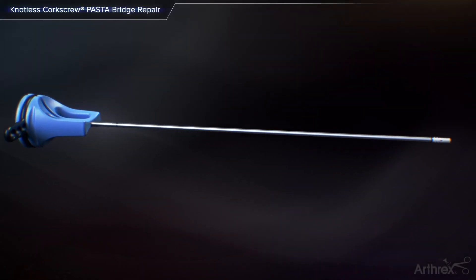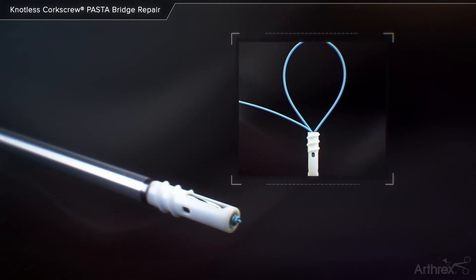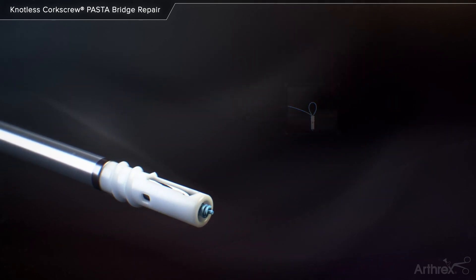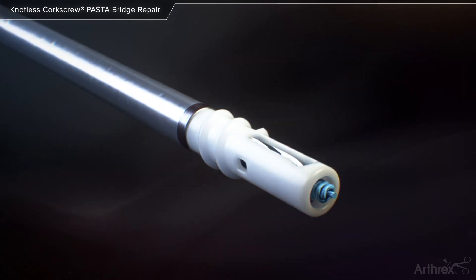Knotless Corkscrew Pasta Bridge Repair. The 3.9mm knotless corkscrew anchor is partially threaded and features a tensionable knotless mechanism within the anchor body. The knotless technology can be used to interconnect two anchors for a completely knotless double row repair.